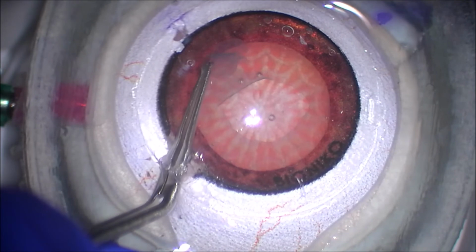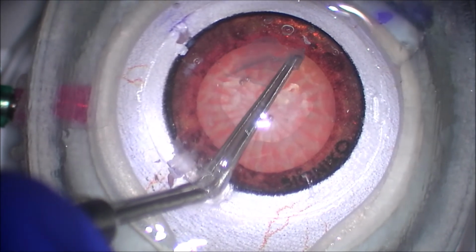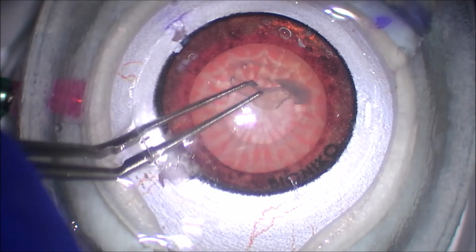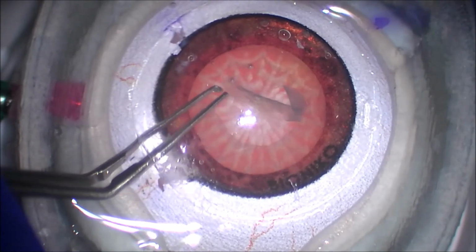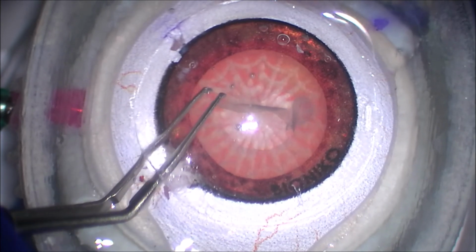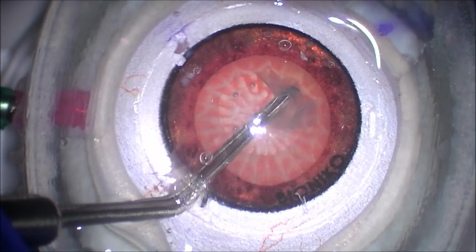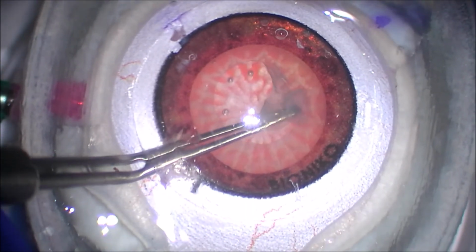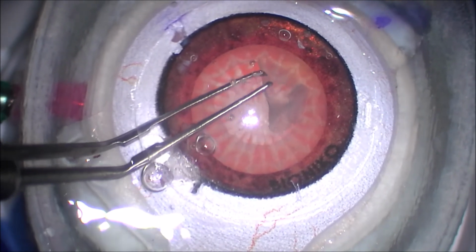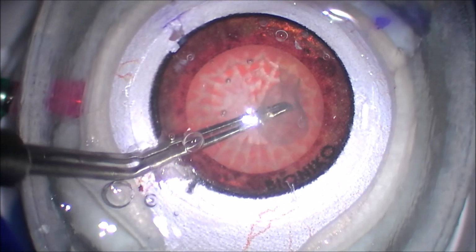Of course, then you have to think about maybe doing some other specialty that's not intraocular surgery, which is, again, not the end of the world, but it certainly would be nice to have a mechanism to really gauge if you're capable of doing intraocular surgery. Again, this is a far cry from real surgery, but nonetheless, it gives some people an idea of seeing through the microscope, understanding depth of field, depth of vision, and how deep to go when you're sculpting, etc. And all of those things are vitally important when you're doing cataract surgery. And I felt like this was invaluable teaching for medical students.